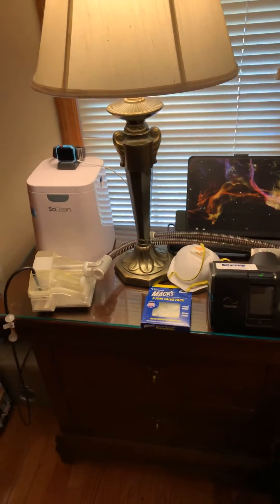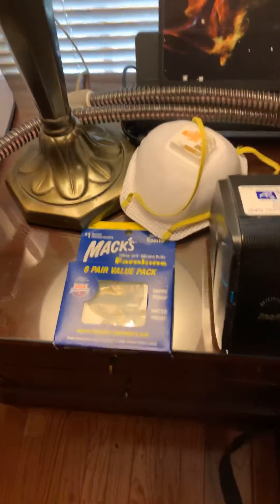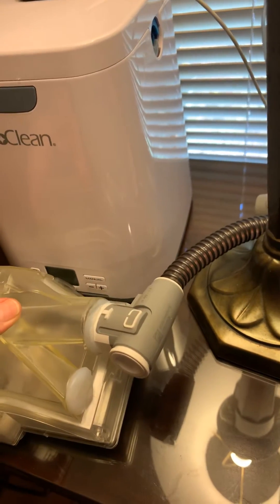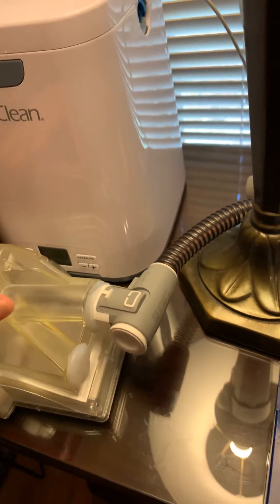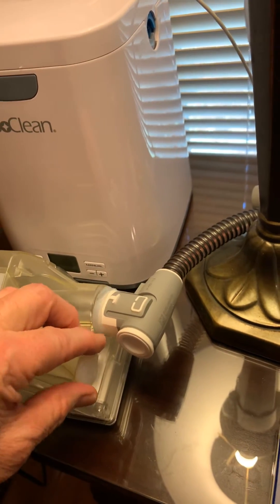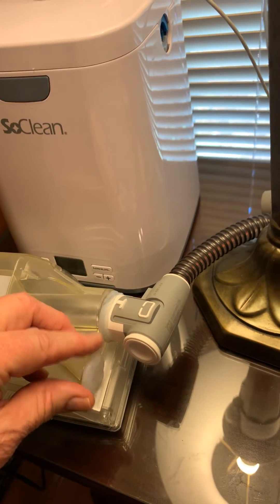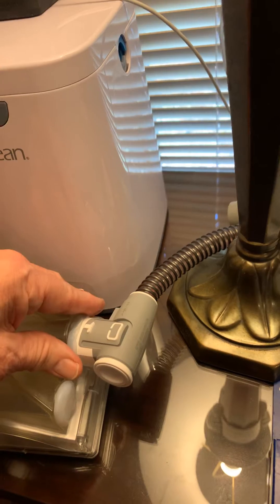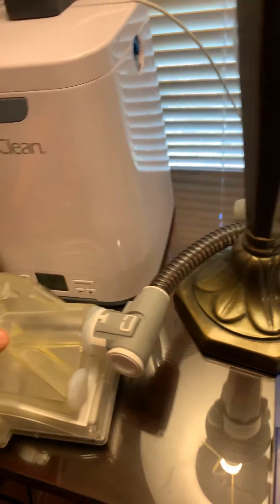And this is what I actually did. I took some Maxx earplugs — very common to find — and with the tub that we normally use for the CPAP for cleansing or sanitizing, I actually plugged up the small tubing with some Maxx earplugs, and then I connected my heated tubing to the large tubing of the tub.